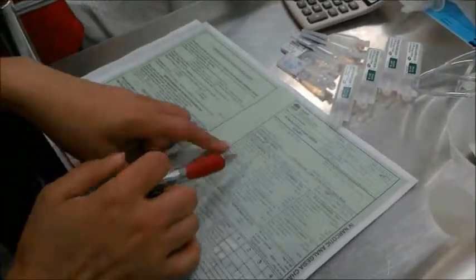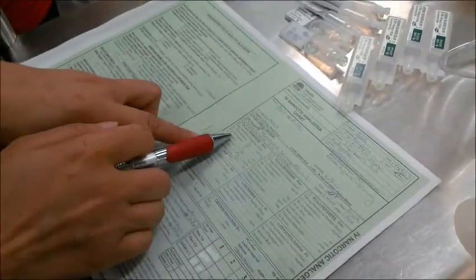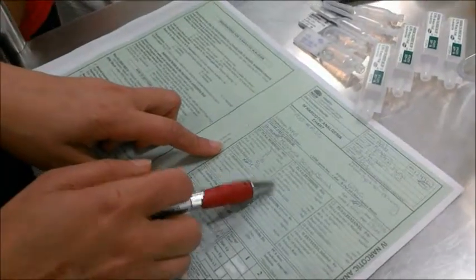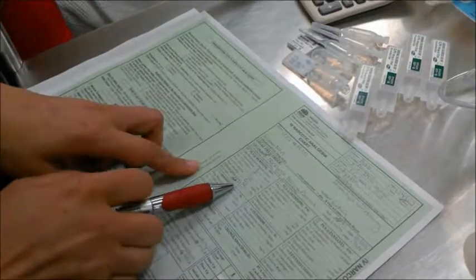And here's my concentration, 1 milligram. Number of syringes is 3. PCA dose is 1 milligram. Lockout interval is 5 minutes per push. Basal infusion is 0 milligram, and hourly dose is 12. It's been signed by doctors.